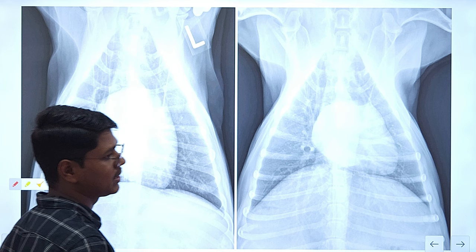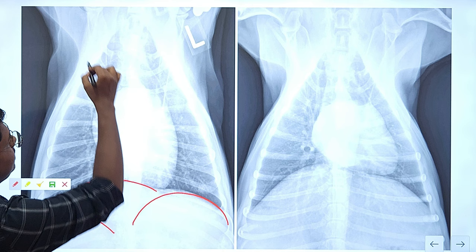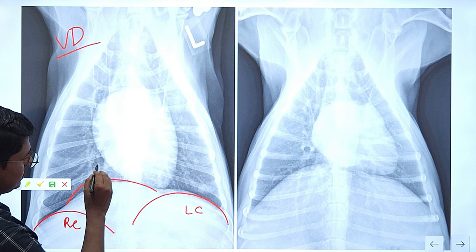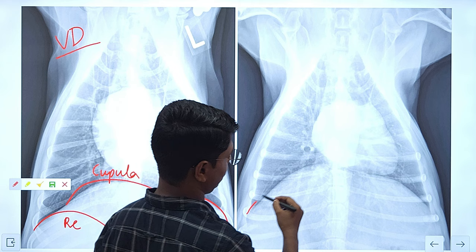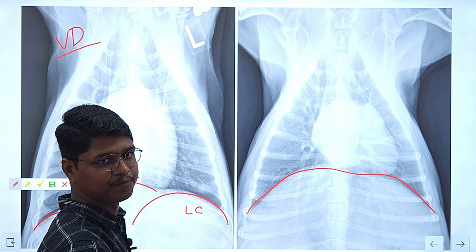Next, the diaphragm in DV/VD views. In the ventral dorsal view you may find three domes: the left crura, the right crura, and the cupola. In dorsal ventral view, you find a single dome — which is basically the cupola — though sometimes two domes may be visible depending on beam positioning.